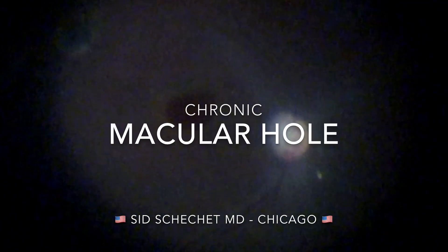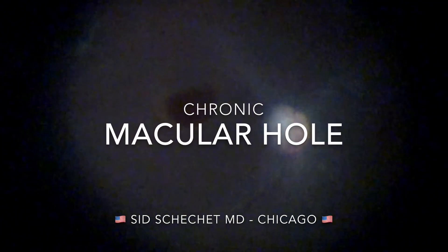This is the case of a chronic macular hole, shared by Dr. Sid Schechet from Chicago, USA.